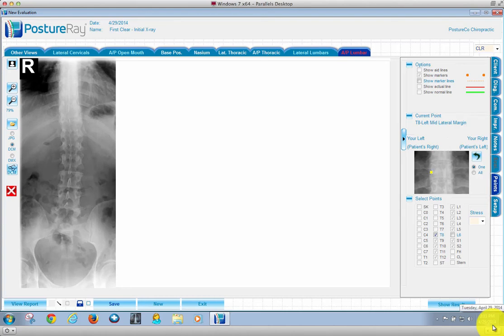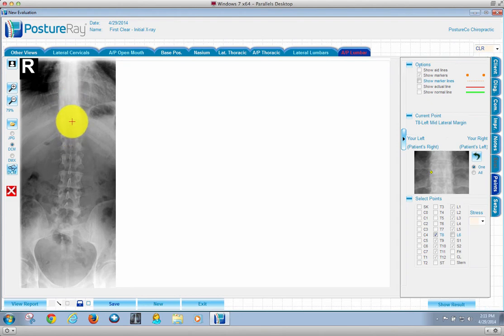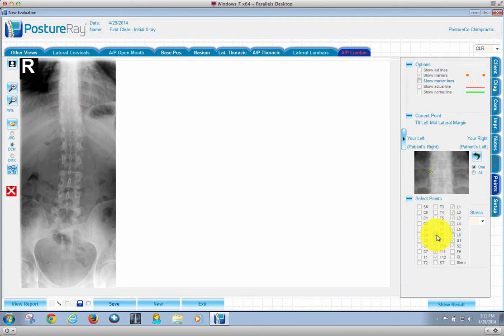In this example for clear analysis, we're going to do an AP lumbar non-scoliosis. So what I'm going to do is I can clearly see 12, 11, 10 very well. So I'm just going to go ahead and uncheck T9 and T8 and do T10.